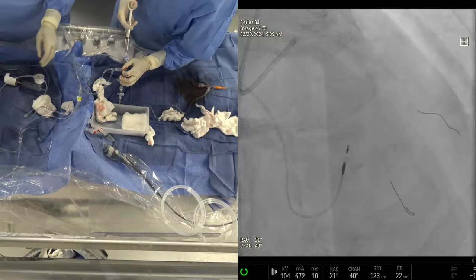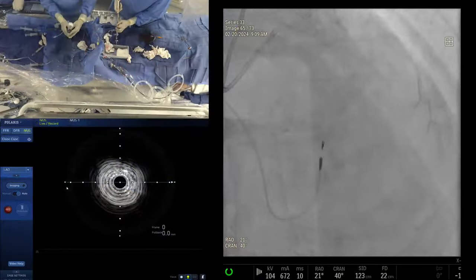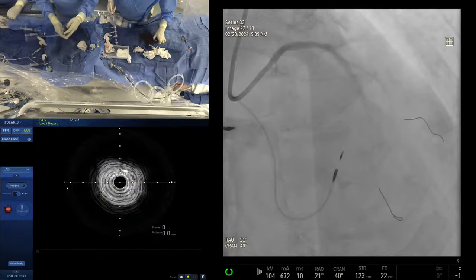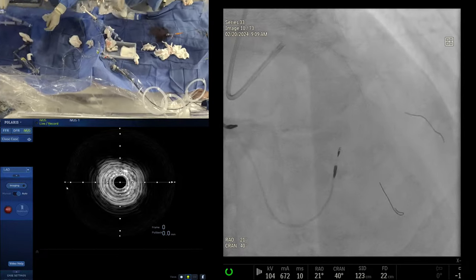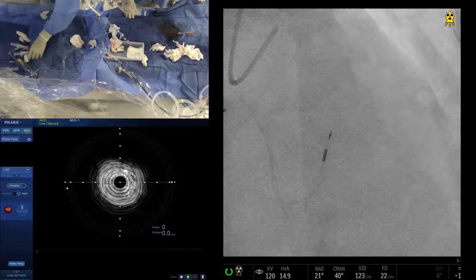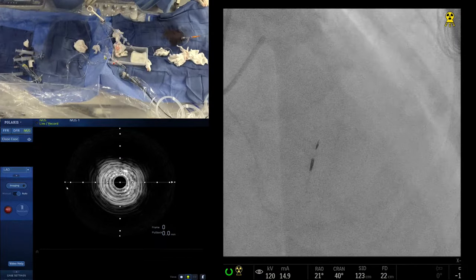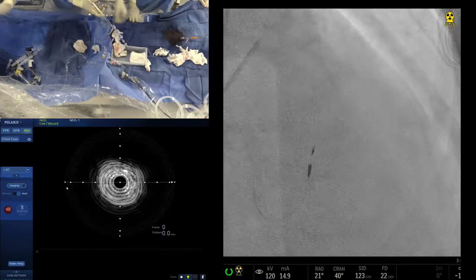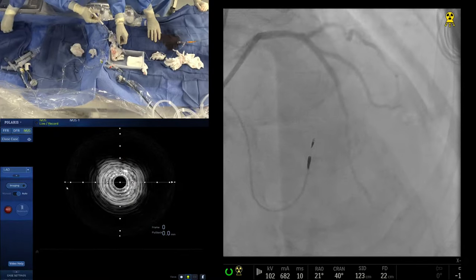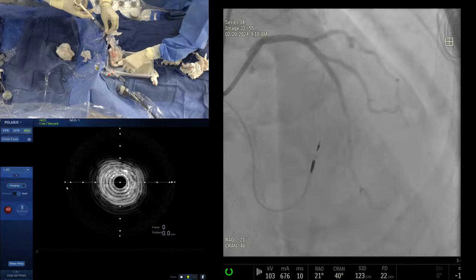We can show you right now. Our published data have shown that with POT versus kissing balloon, you have more spherical shape and less stent malapposition using kissing balloon dilatation rather than POT. So in the left main we will definitely do a POT. Some people do POT, then re-POT, then kissing. They're not needed, believe me. Kissing balloon is good enough; in a left main, POT, yes. And see that, beautiful results.